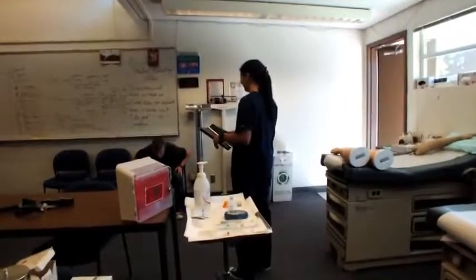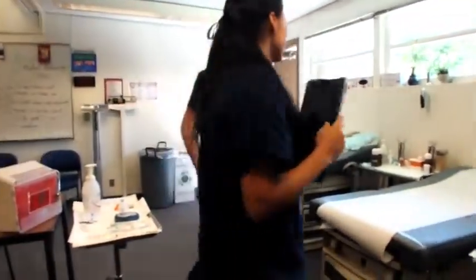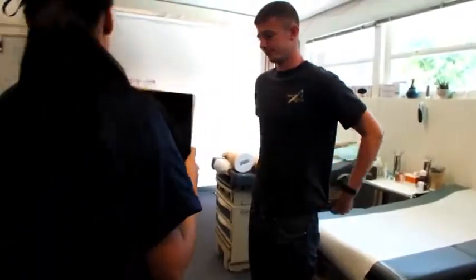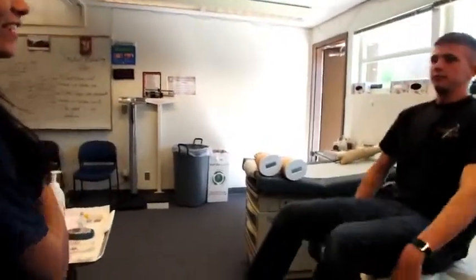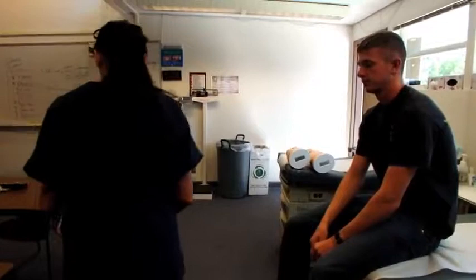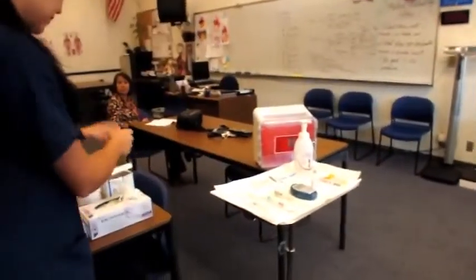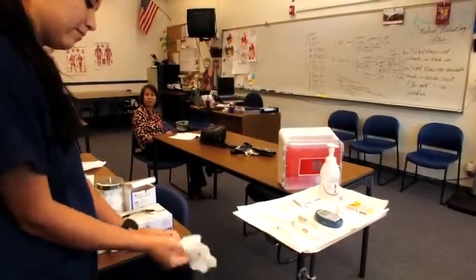Sean? Okay, can I get your name and date of birth? Sean Cunningham, 10/25/94. Okay. So today I'm going to be doing an intramuscular injection. It's going to go in your deltoid right here. It's for your flu shot. The doctor ordered it. Alright, first I'm going to sanitize my hands, put on gloves for safety precautions for both me and the patient.